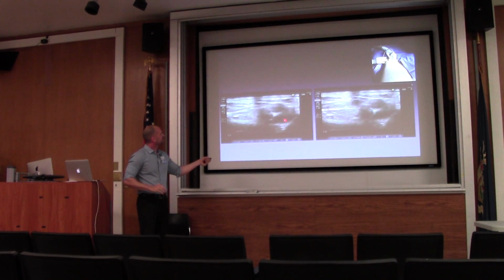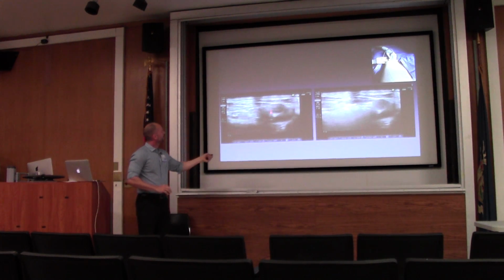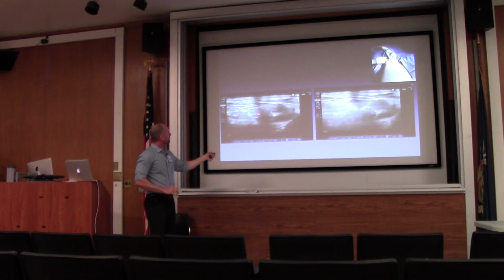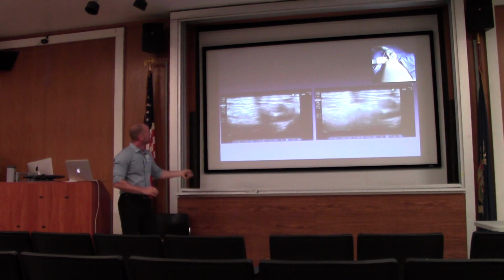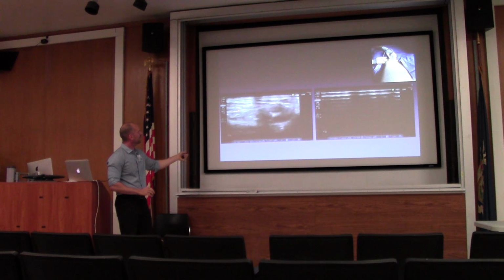And so essentially what you see is the artery, the vein, the artery. This is that crappy ultrasound that has that permanent shadow. And this is where the nerve is, right here. And what this is trying to make out over here is the iliopsoas muscle. And this is the needle going in. And here you can see this dissection along this fascial plane.